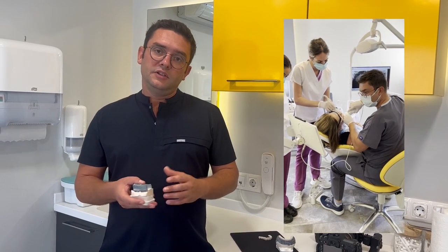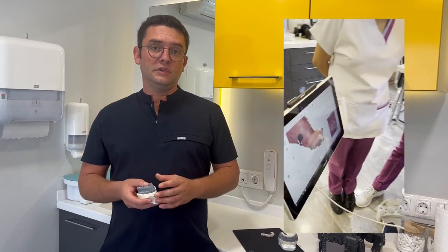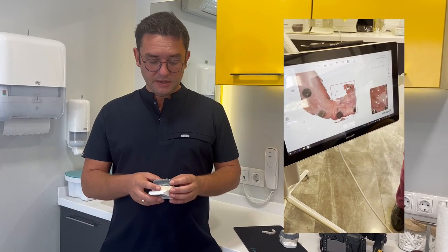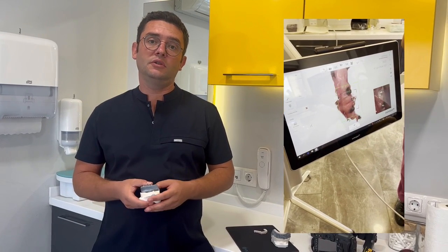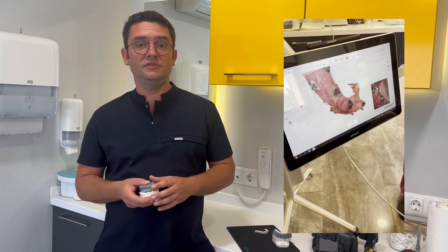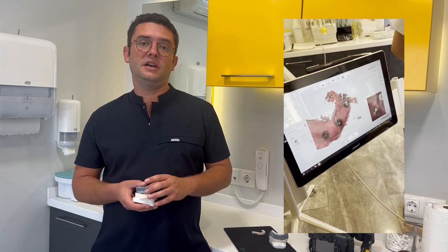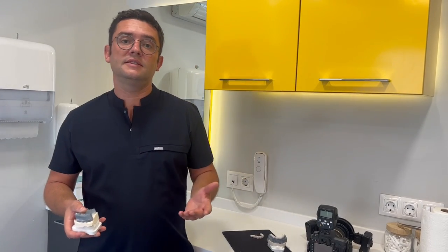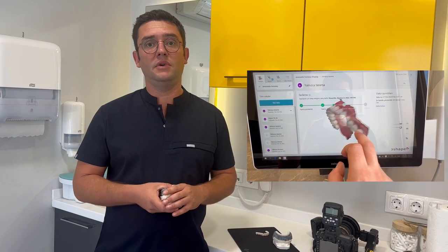After 3 months passed, our patient visited us again for a 2-week appointment. We took her impressions with a digital intraoral scanner. Digital technology is very important in this treatment because time is very limited — this patient is living in Ireland and cannot stay any longer.